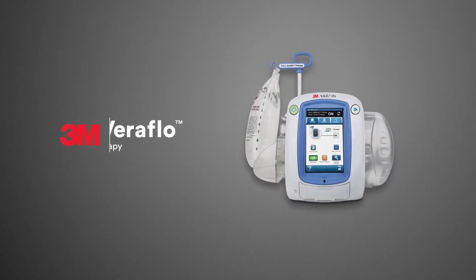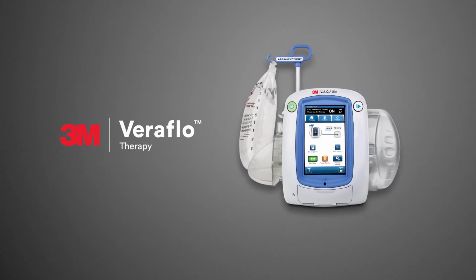Things like, for instance, negative pressure wound therapy. What does that do? We've known this for 25 years, to help granulate that wound bed up so that we're going to be able to get it skin grafted. But then something else came along called instillation. And now we have 3 strong arms to try to get that wound granulated to heal. So we can use all of these things, negative pressure wound therapy, which has the macrostrain and the microstrain, and instillation to help us get that wound to granulate, to get it towards closure.